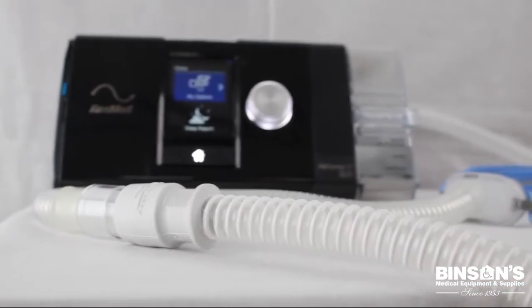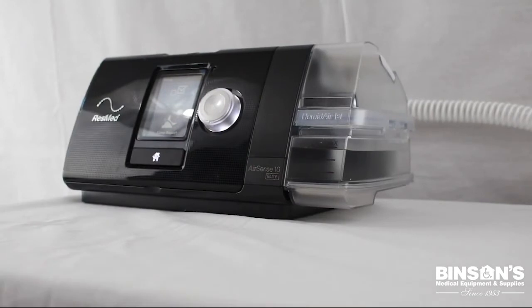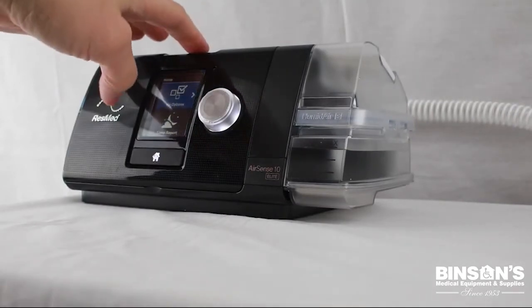Your machine is now set up and ready to use. To start your therapy, put your mask on and push the start button on the top of the machine.